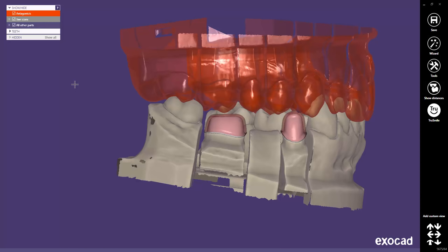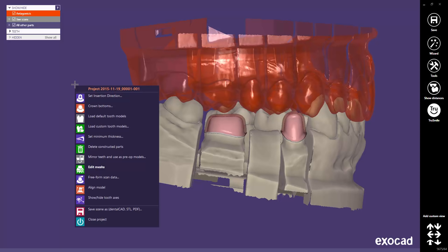Did you know that you might also use the expert mode with the right mouse context menu? If you do a right mouse click in the background, you can access the expert mode in the context menu. You can now go to the crown bottom step to adjust the cement gap settings. These new settings will be applied to all teeth, just as if you use the expert toolbar without any selection.